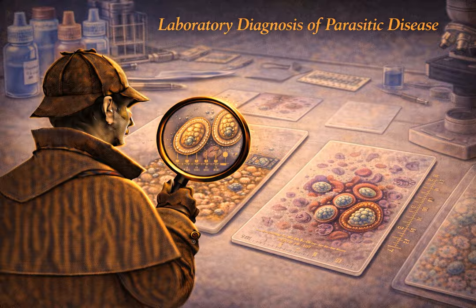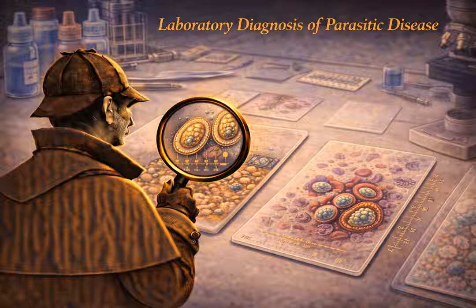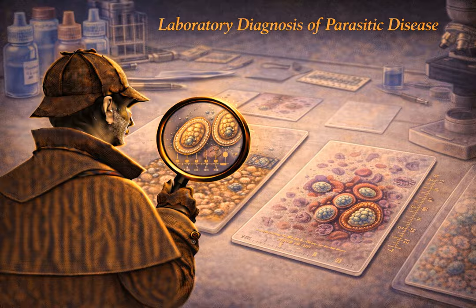Not reliably, and definitely not safely. Remember, a lot of these amoebas look nearly identical under a standard wet mount. Let's take Entamoeba. Entamoeba histolytica is a ruthless killer. It causes severe, bloody dysentery and massive liver abscesses. But Entamoeba coli, same genus, completely different species, is just a friendly, harmless, commensal organism. It lives in your gut and does absolutely nothing.